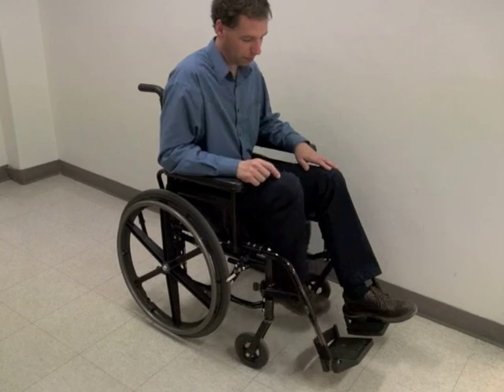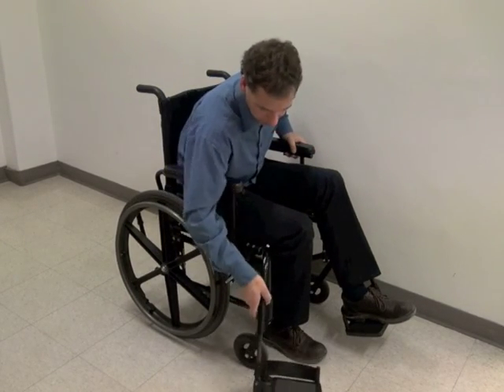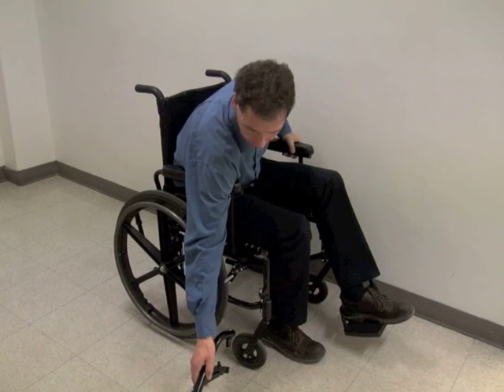Just like leaning forwards, if you are reaching towards the right side, try and hold on to the armrest or backrest with your left hand to keep your balance. Never lean further than you feel comfortable or to the point where you can lose your balance. The biggest risk when leaning is that you fall sideways or, although very unlikely, the wheelchair tips sideways.